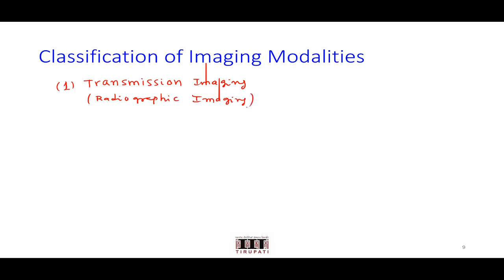Okay, and another one which you had already seen now is like what happens in visible light, you could call it reflection imaging. I don't know why when A comes it gives a peak there, some issue with the pen. Anyways, reflection imaging. So here we would be talking more about ultrasound imaging. That's what we would take a look at here, ultrasound imaging.